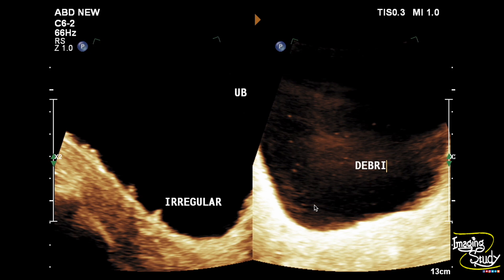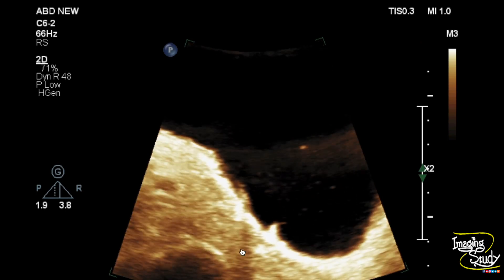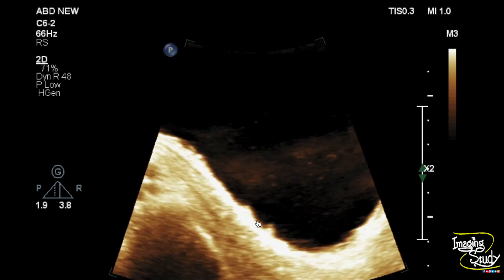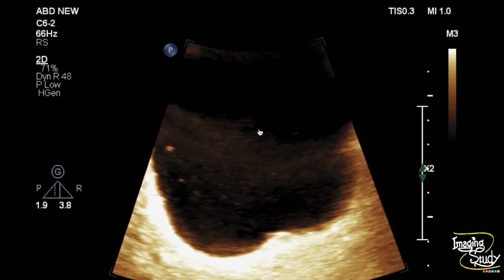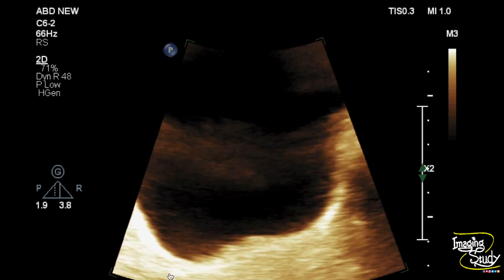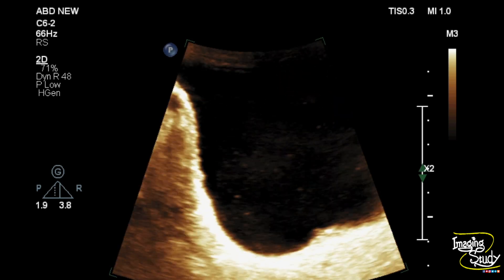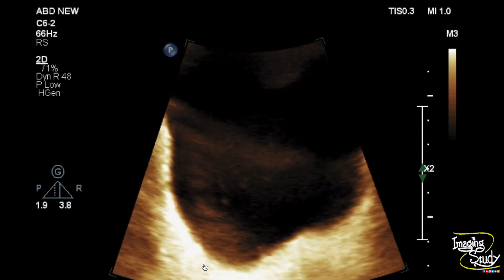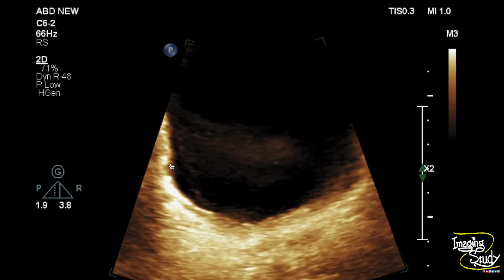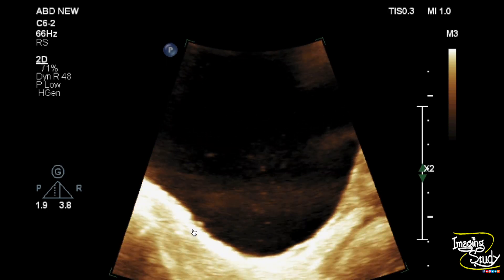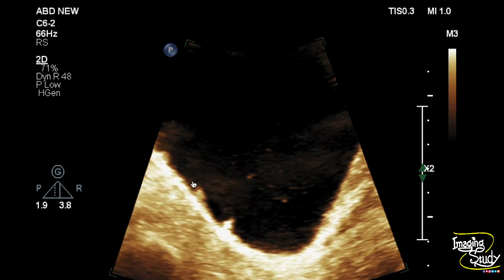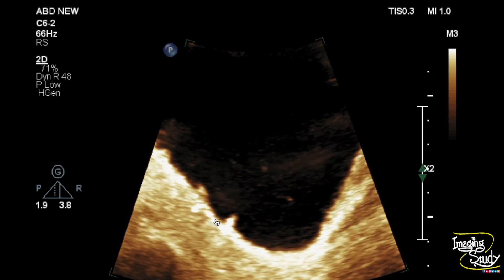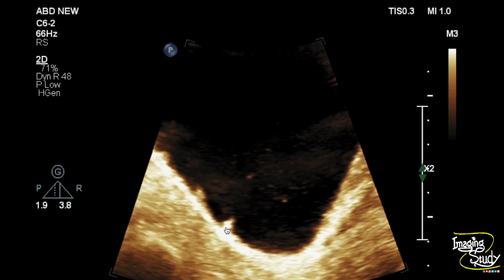Here you can see multiple irregular wall thickenings of the urinary bladder and also some echogenic foci within the urinary bladder lumen. This irregularity of the bladder wall may be confused as polyps, but polyps in the urinary bladder are quite uncommon in comparison to bladder wall trabeculations, which are commonly seen in chronic cystitis.